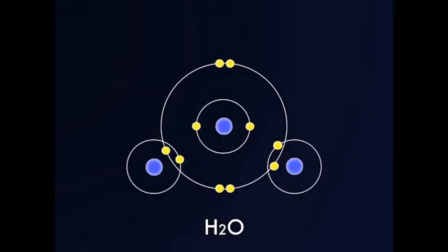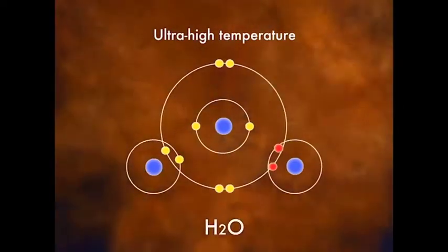Cavitations are, of course, microbubbles. They're produced by a sudden drop in pressure in a liquid. Pressures and temperatures inside the bubbles rise precipitously when these tiny bubbles collapse, and the molecular bonds in water are broken, and radicals of oxygen and hydrogen, hydroxyl radicals, are generated.